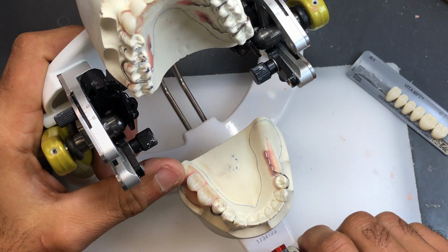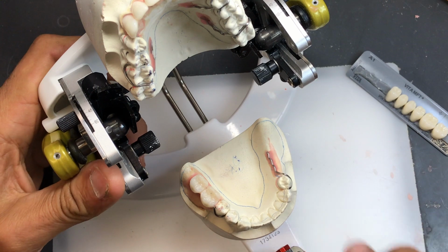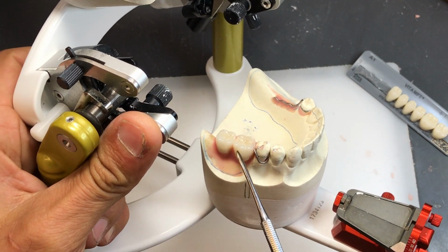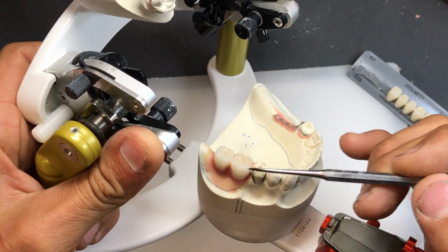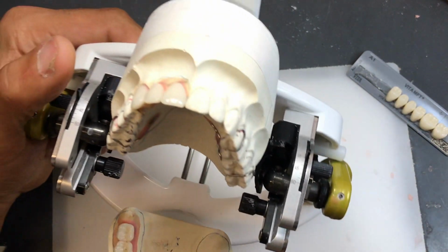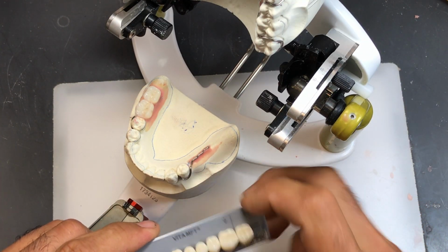Now, when you're setting up posterior teeth against natural posterior teeth, you have to set them up, as I did on this side, slightly higher than they need to be, so you can grind in the bite a little bit and still preserve most of the anatomy on the tooth. Okay? All right, so I'm going to start off with our second bicuspid right here.